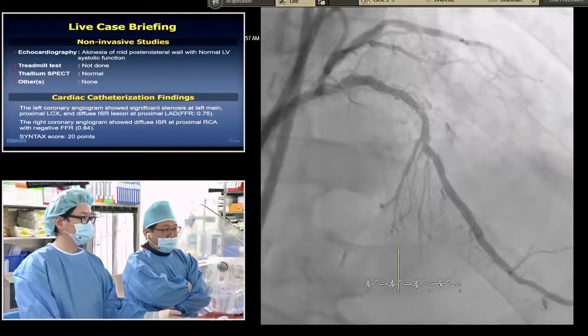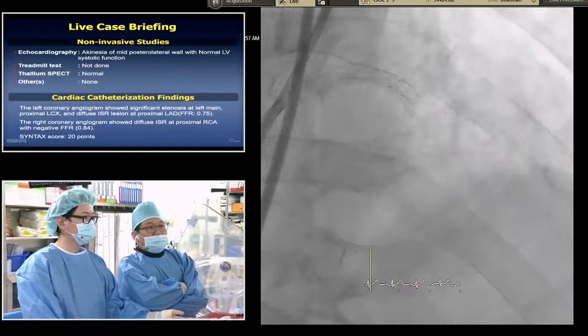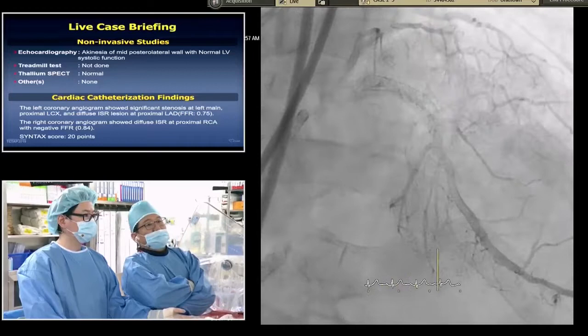What about the information of the right coronary artery? Actually, in this vessel, the size of the circ is not so big. So please show us the right coronary angiogram. Could you show? I see it.